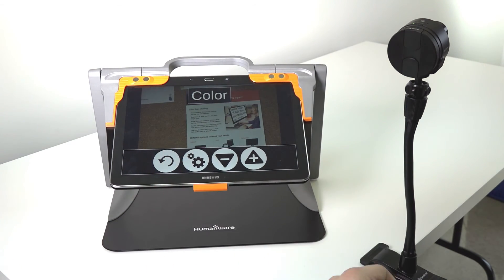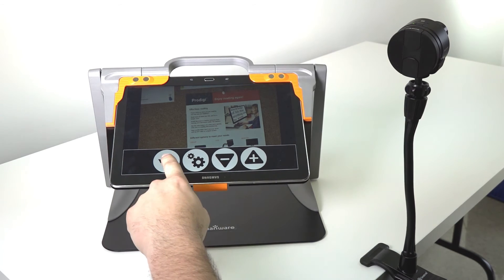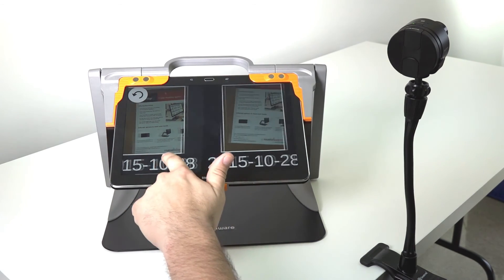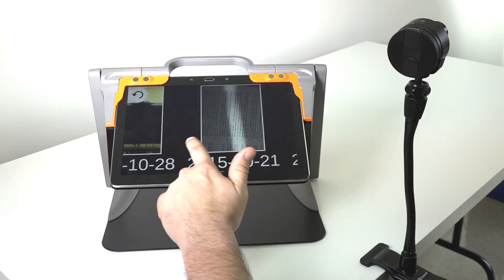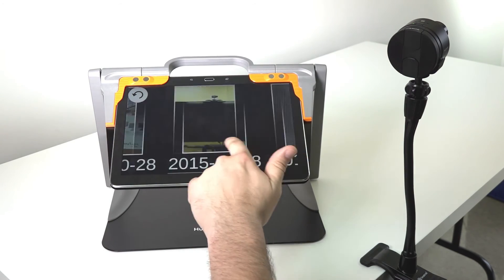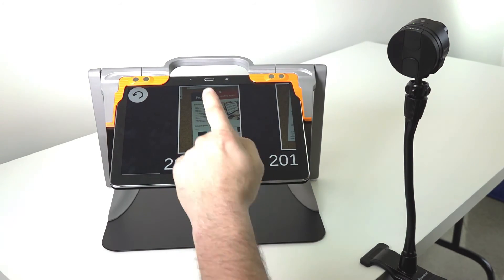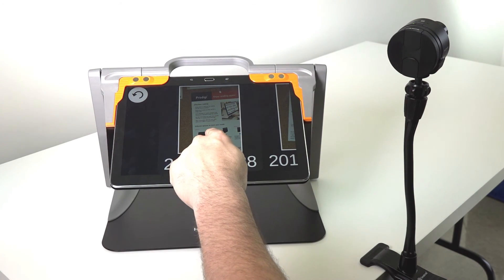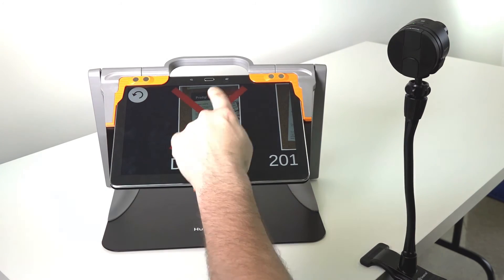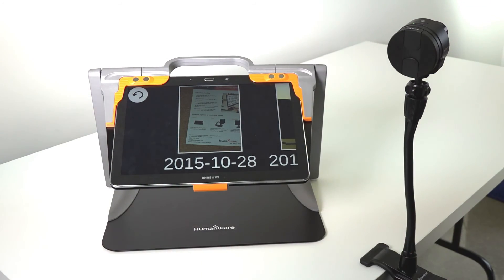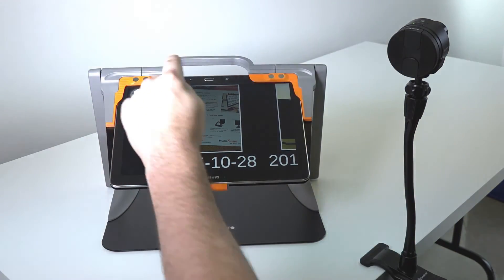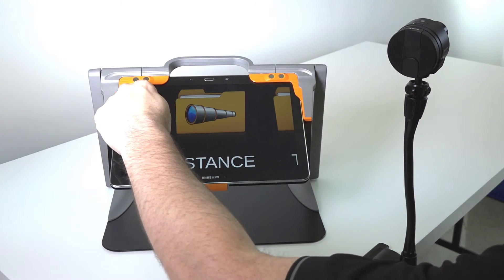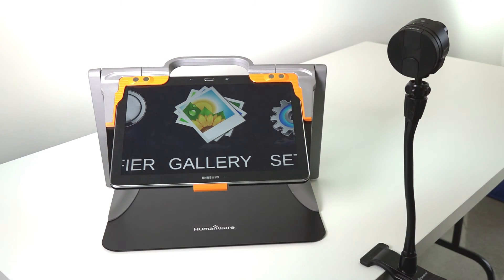When you hit the back button, you can go back to the carousel and all previous images that you've captured will be there. A document can also be deleted by tapping and holding and confirming the deletion. Press the back button once you're finished to exit back to the main carousel.